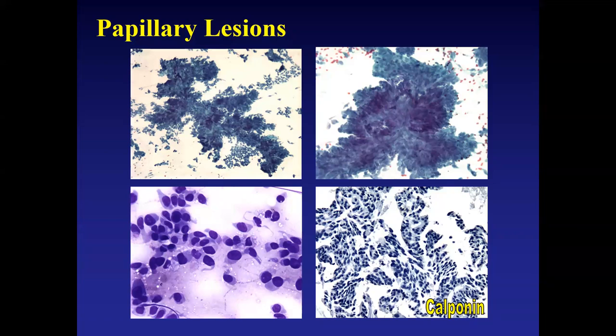Myoepithelial cells are supporting cells of the ductal element, and they are there around the ductal system. Whenever there is a neoplastic process happening, they refuse to participate in the process because they're a supporting component. They don't want to become involved in a neoplastic process, so they go away. So whenever myoepithelial cells go away in your progression, it means that you are probably looking at a neoplastic process. And this is exactly what you're seeing in here versus what I just showed you.